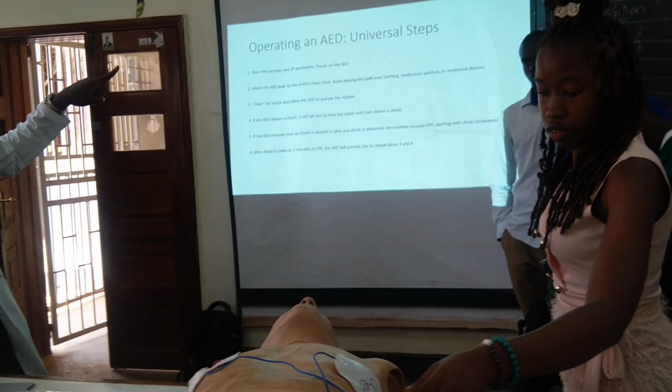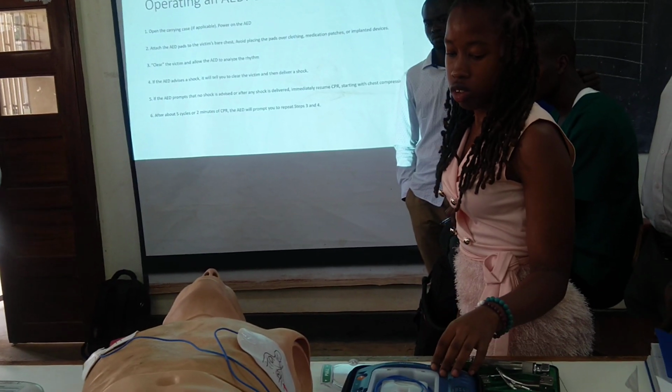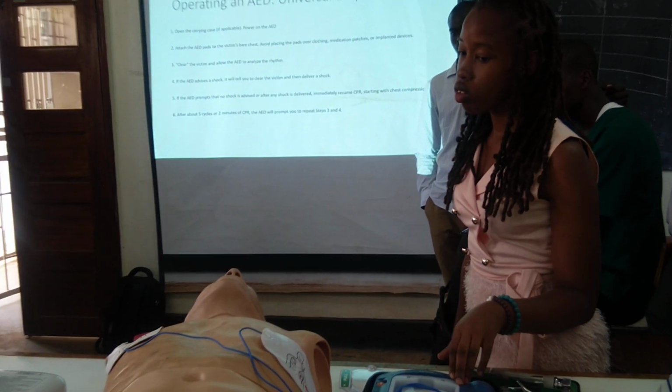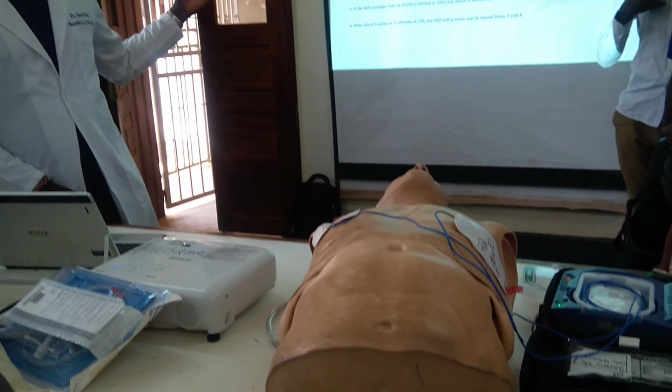If you are doing the chest compression, you have attached the pads the way it is now. The AED will tell you to press pads firmly to the patient's bare skin. When you have done that, it will tell you to clear the patient to allow the AED to analyze.